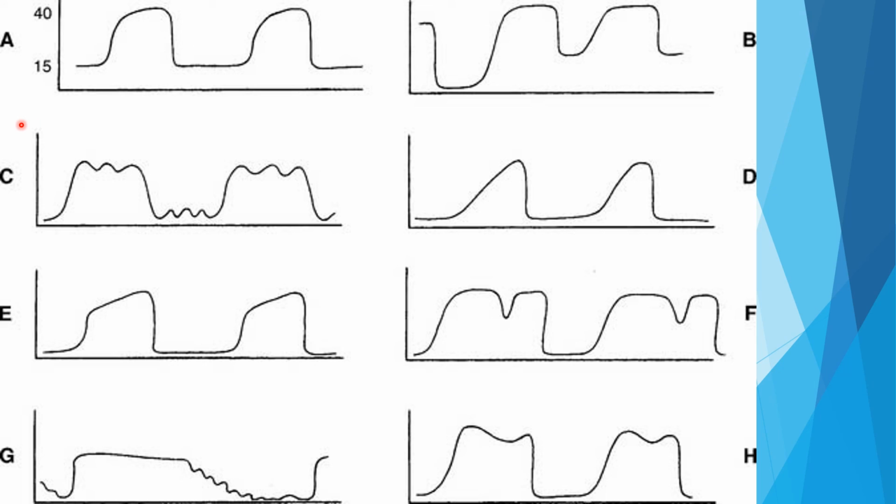CO2 level is elevated because the patient's exhaled breath is measured during inspiration. And what you need to do here is check your exhalation valve, probably change it out. What's going on in B is, it looks good here, but it doesn't return to baseline. So basically maybe there's moisture or something blocking your sampling tube.